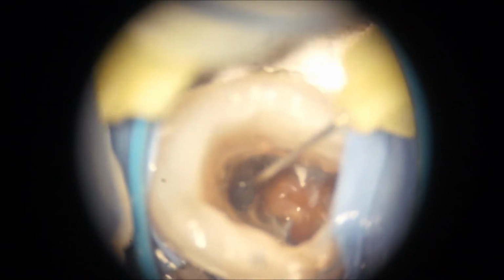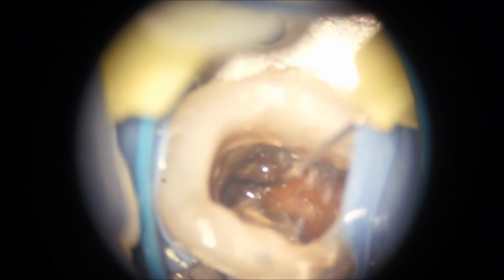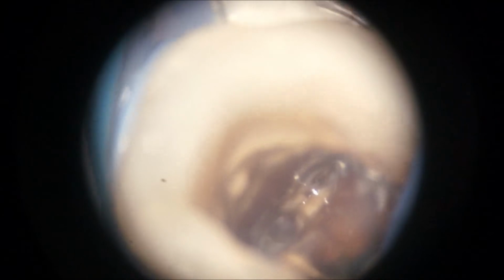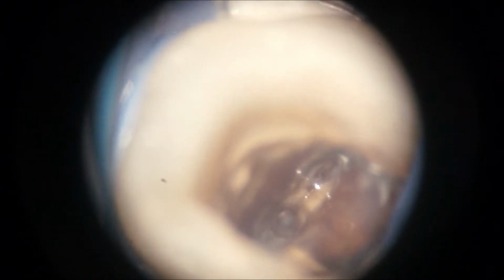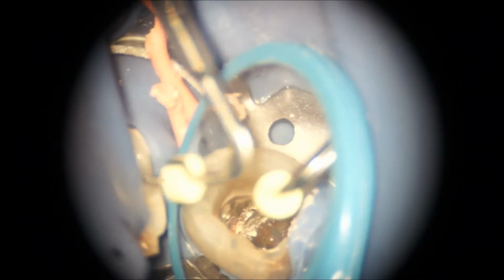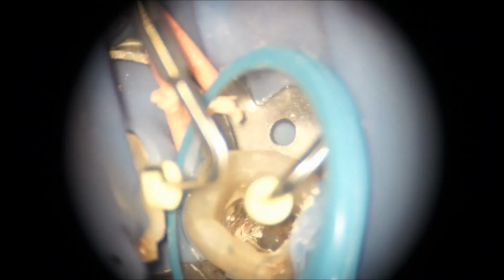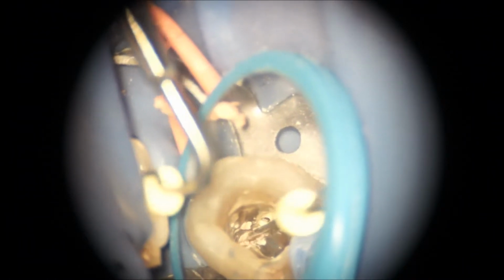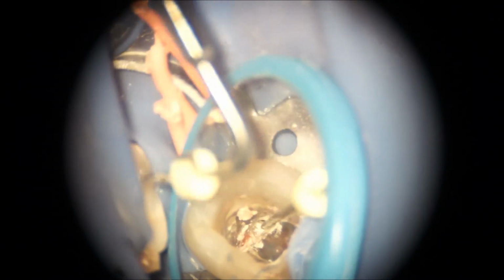Distal was a single canal, although I heavily suspected a double canal, but it turned out that the extra mark that you might see to the top right of the actual canal was created at one of the earlier attempts at root canal treatment. The flare-up the patient experienced when we disturbed this chronic irritation was so acute that she actually had to get intravenous pain medication from a hospital facility.